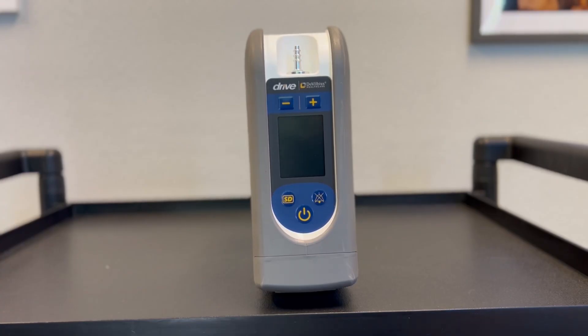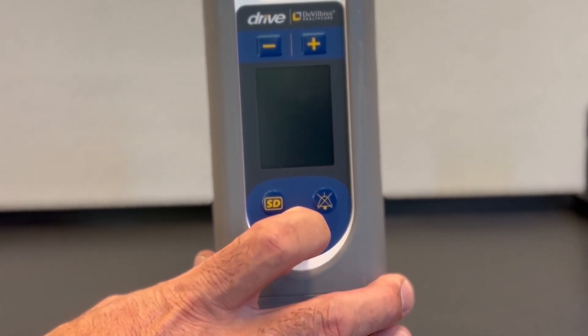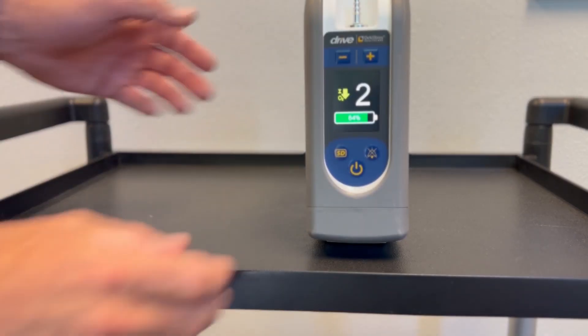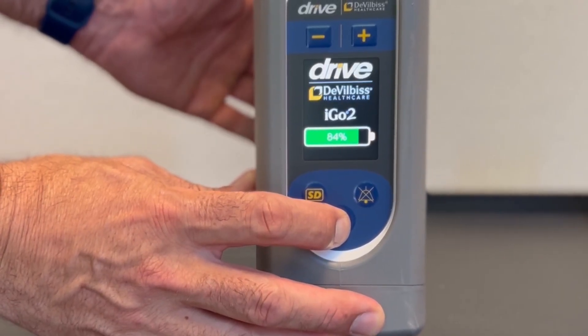To turn on your iGo 2 Portable Oxygen Concentrator, press and hold the on/off button for two seconds. When you hear the alarm, the machine will start up. To turn it off, press and hold the on/off button again for about two seconds.